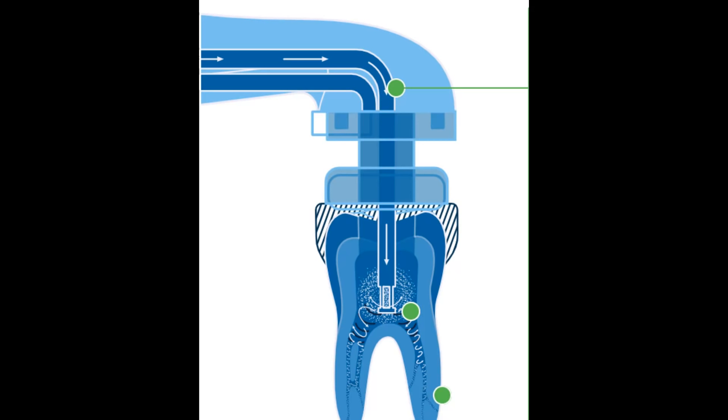That's what makes sure that it's safe to use sodium hypochlorite in here, even in open apex cases and cases that are under the sinus. Now, there was a question earlier about negotiation before GentleWave. How much are you going to do? If you have roots in the sinus space, you want to be super careful. You probably don't want to be patent. This is a new paradigm in endodontics. For decades, I've taught people to be patent. And since all this debris gets knocked loose and sucked out coronally, we don't have to worry about packing pulp tissue at the end of the root canal or dentin debris.